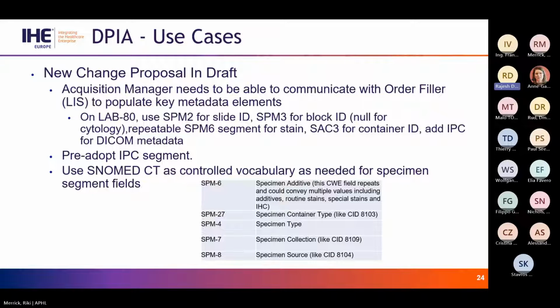And just as an example, we've gone back and forth on whether to use SPM6 or a pair of OBXs to recognize what the stain is. And I think we've settled on SPM6 as a repeatable field to be able to accommodate the multiple stains that might be present in a single whole slide image. So more to come on that. If you have software that's functioning in this arena, please join us. Next slide.